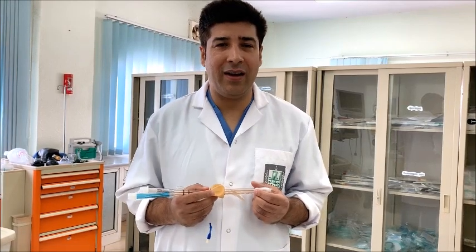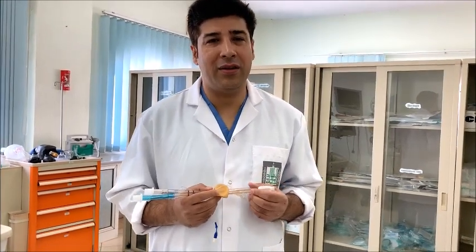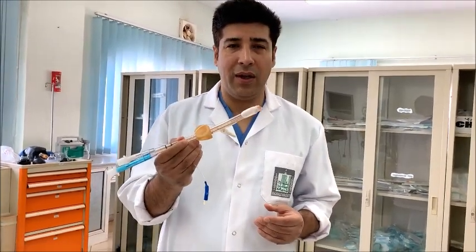Hello, I'm Dr. Munir Jaan, Assistant Professor, Anesthesiology and Intensive Care, King College University, College of Medicine, Department of Surgery. Today, I'm going to talk about the Combitube.